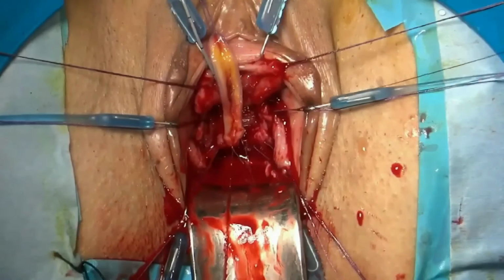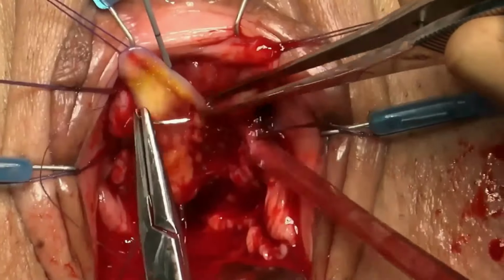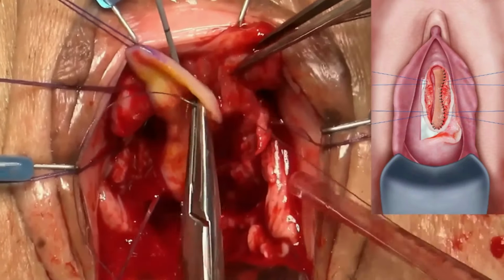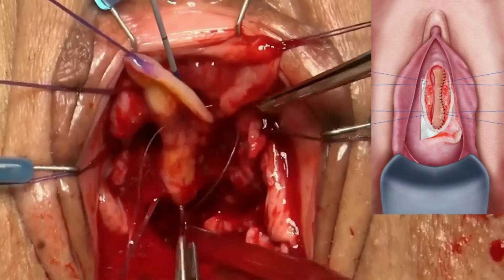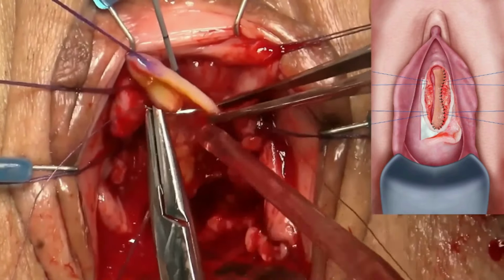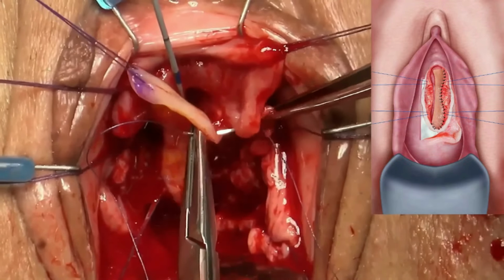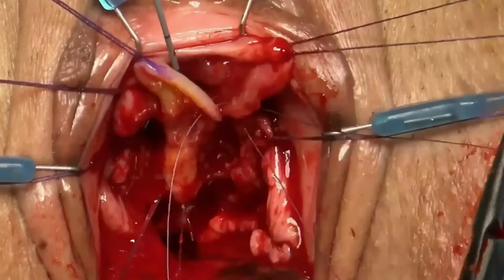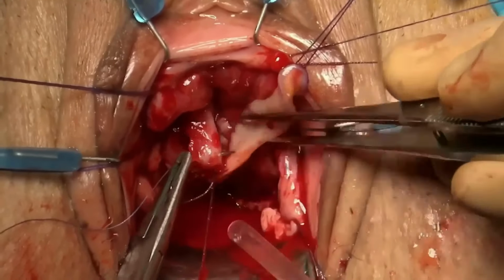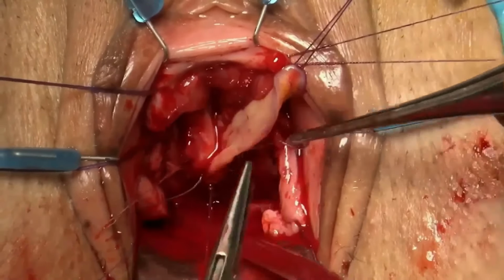The buccal mucosa is attached to the left side of the urethra by means of 5-0 polyglactin suture in running fashion. The same procedure is made for the right side of the urethra.